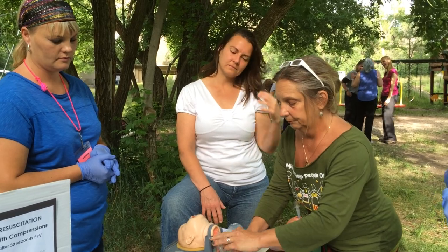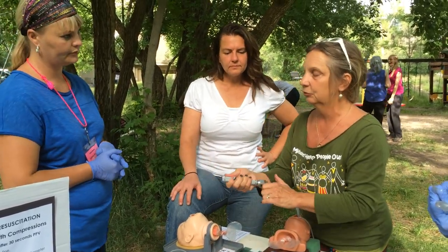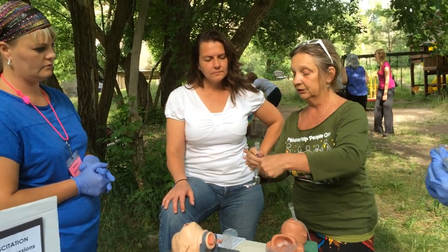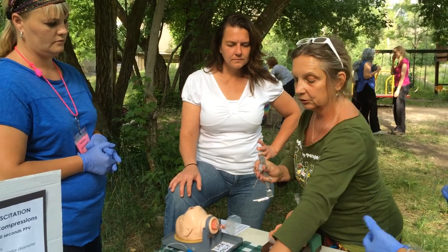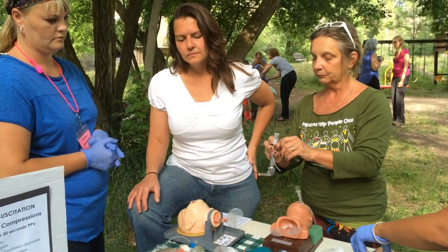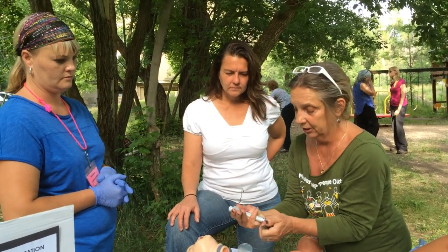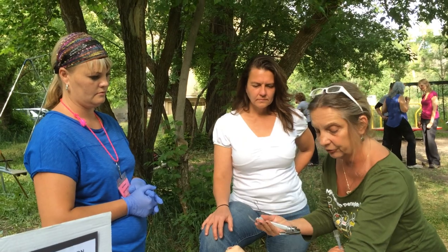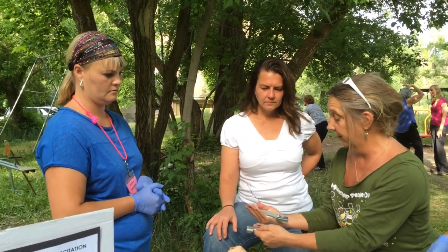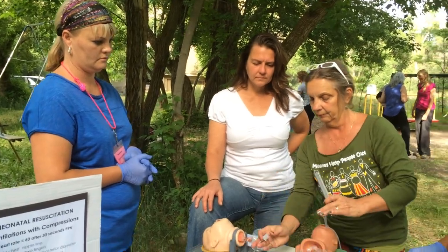If you haven't ever seen a laryngoscope and used one, this is so that you can see the process and how it works. This is all the equipment you have to carry. You have to carry two different of these. You have to put batteries in here, so you always need another set. Usually you have two blades, a large and a small.